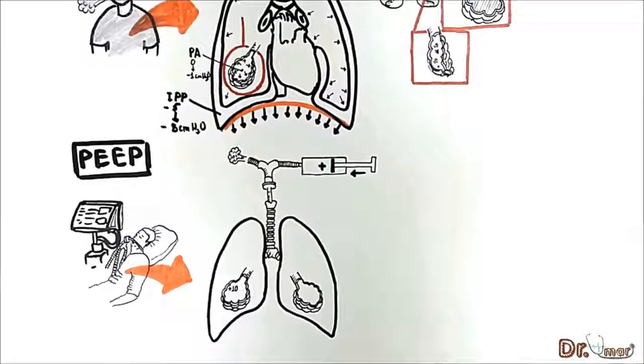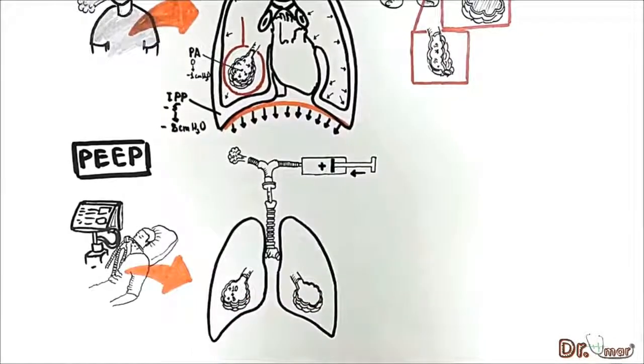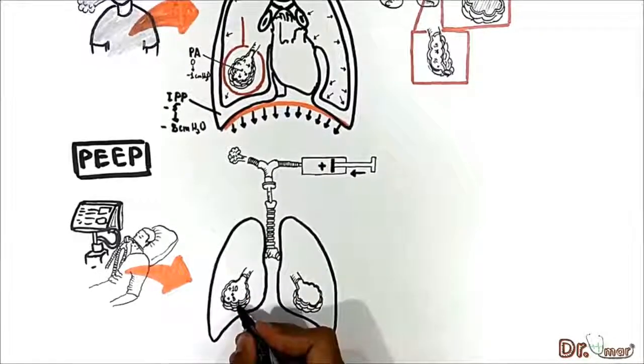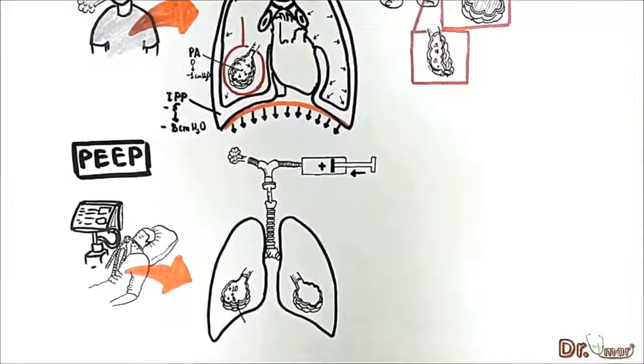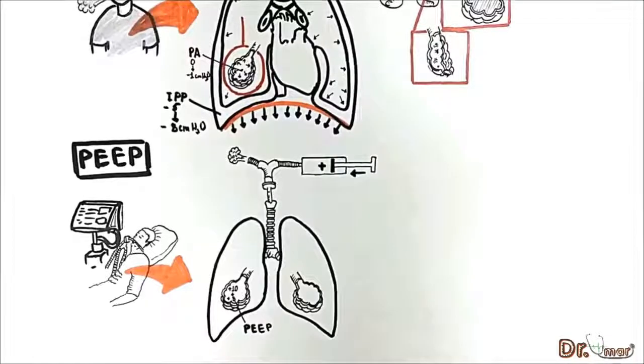Suppose the alveolar pressure drops from +10 down to +8 cm water, and expiration terminates at this pressure. This termination pressure is referred to as positive end-expiratory pressure. We will not allow the pressure to fall to 0 because the reinflated alveoli again collapse.